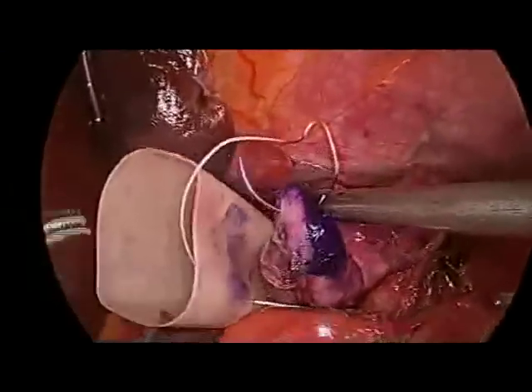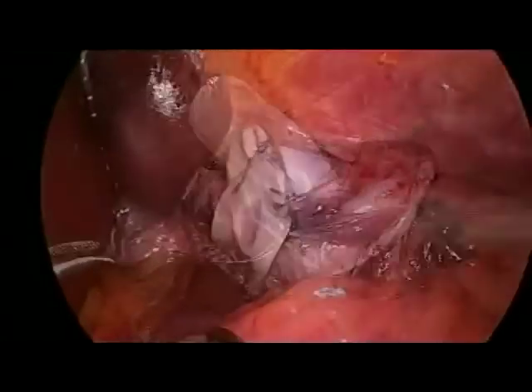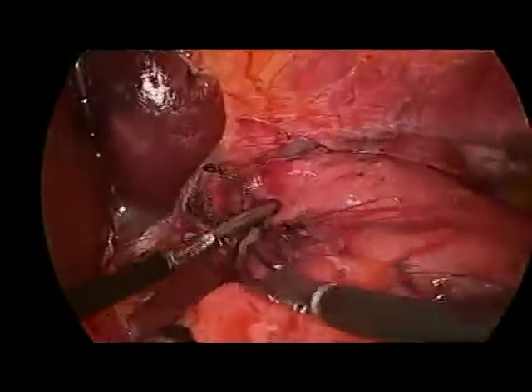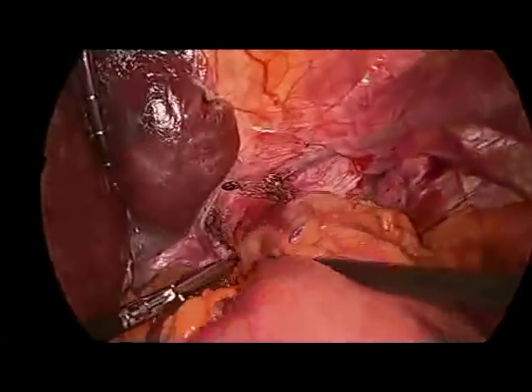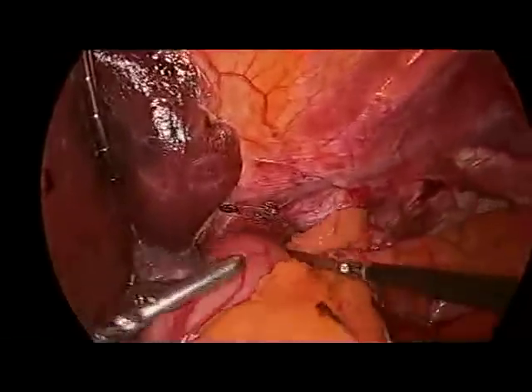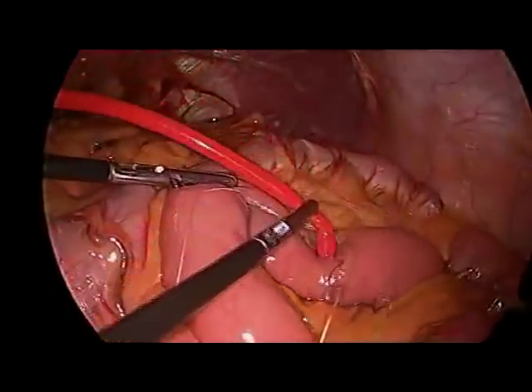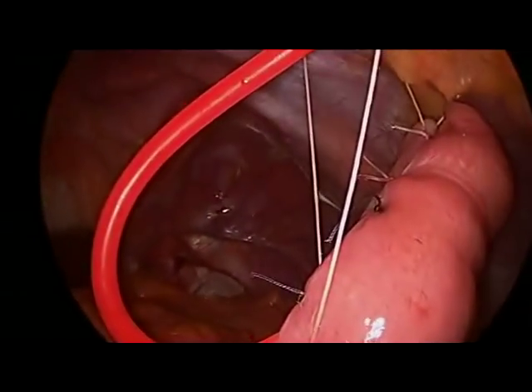Each cut margin of the stomach is sutured to one of the two ends of a 1-inch Penrose drain. The cervical esophagus has been dissected, and the stomach can now be pulled up through the hiatus and the chest into the neck. The anastomosis of the stomach to the cervical esophagus is then performed in an open fashion through the neck incision. A feeding tube is placed laparoscopically in the proximal jejunum and anchored to the anterior abdominal wall in two places via a Witzel tunnel.